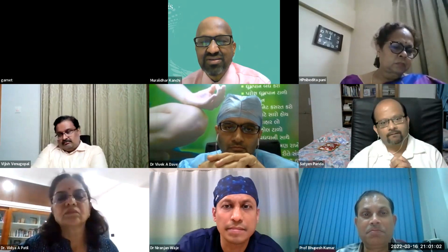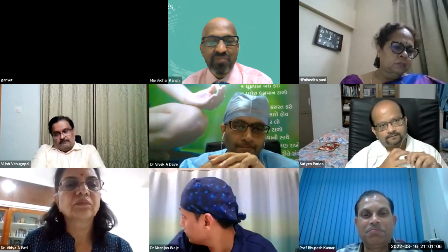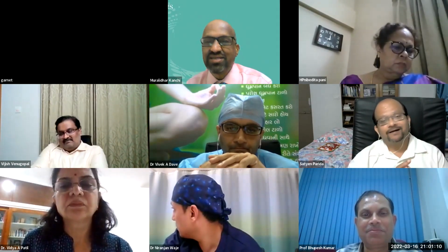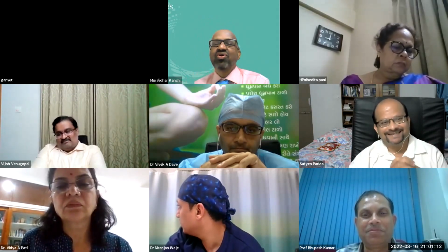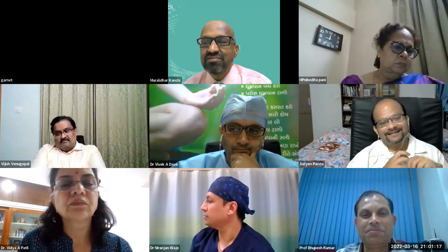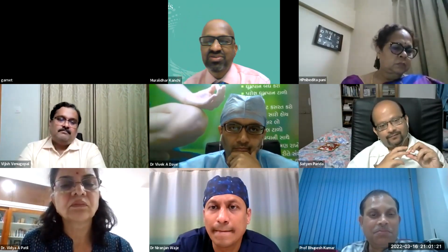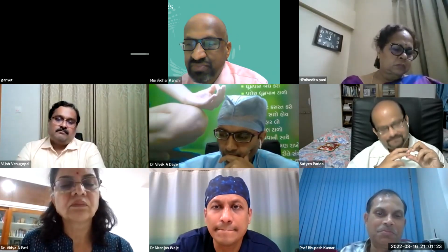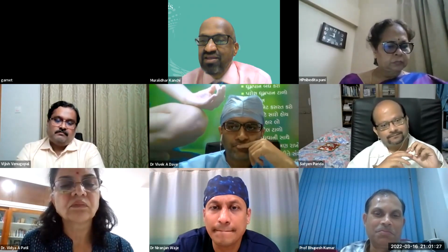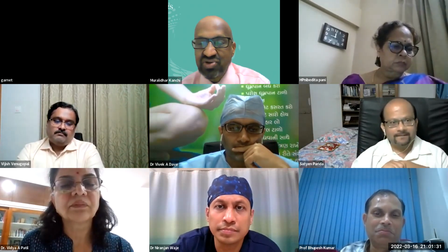I have used it in heart surgery, but the machine cannot predict when the surgeon is going to lift the heart. Exactly. So in cardiac surgery, it's virtually useless. The hypotension prediction index crosses the 85 threshold when the heart is lifted. That is after the event has occurred. It is telling us after the fact.